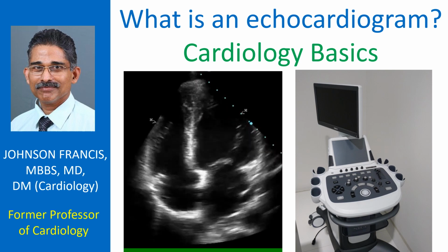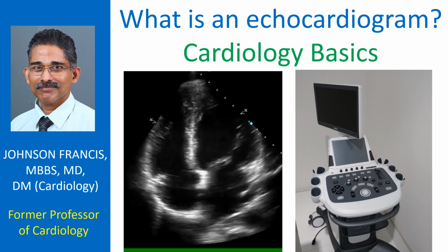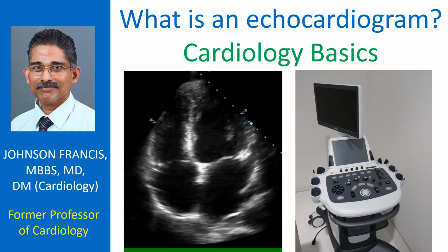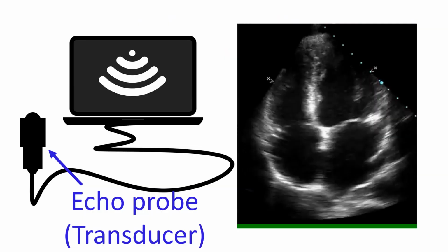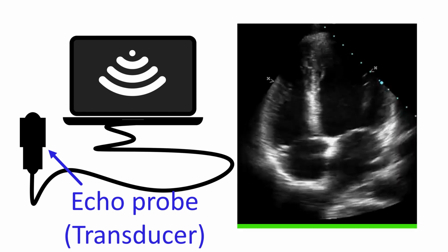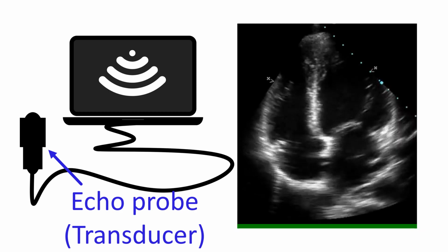For example, if duration of a pulse of ultrasound is about 1 microsecond, the next 999 microseconds are spent for receiving echoes from the body structures. This goes on in a cyclical fashion. Computer synthesized images are then produced from the echoes received from various parts of the heart. It is similar to the location of aeroplanes in the sky by radar system.